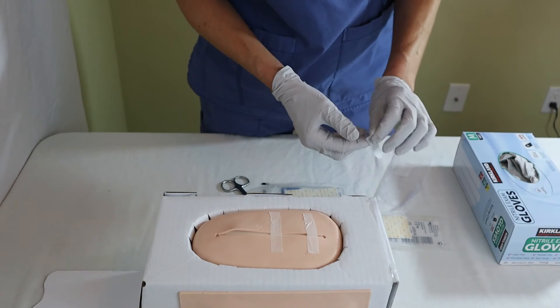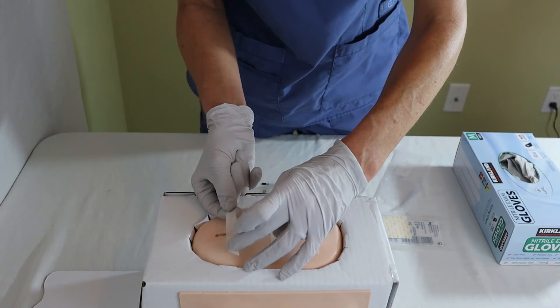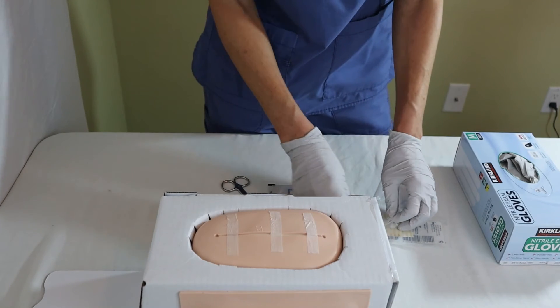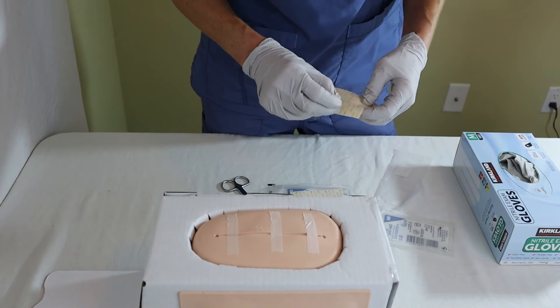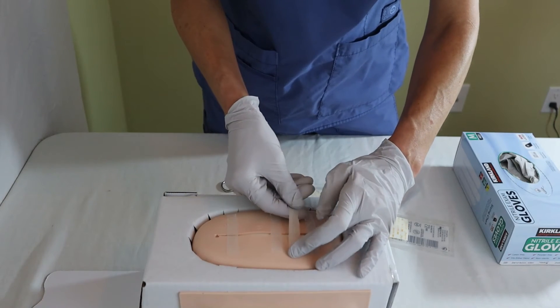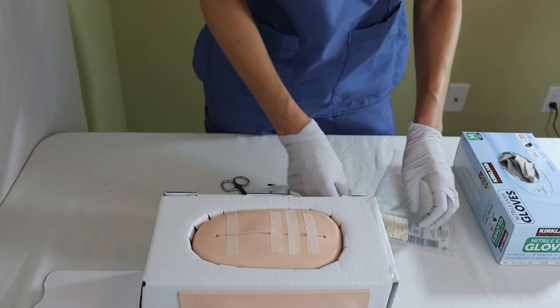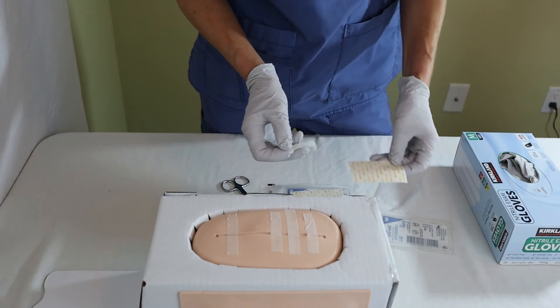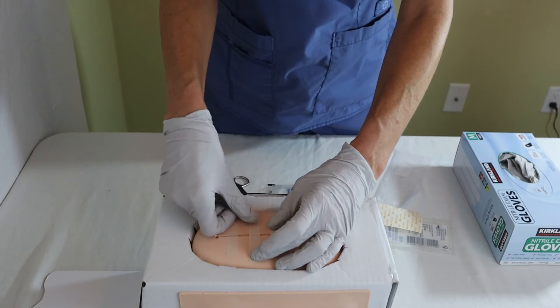On this particular mannequin simulator, the SteriStrips don't stick that well, but the tincture of benzoin definitely helps if you have it available. Now that I've secured these three, I'm going to place a couple more in between — always pulling one end down on one side and then really pulling on the tab so the wound edges come together. They're not perfectly the same length or cut, but that's perfectly fine as long as we have them together.